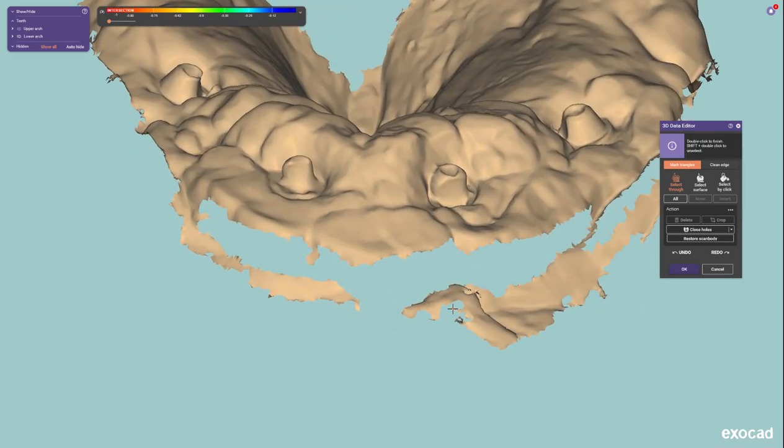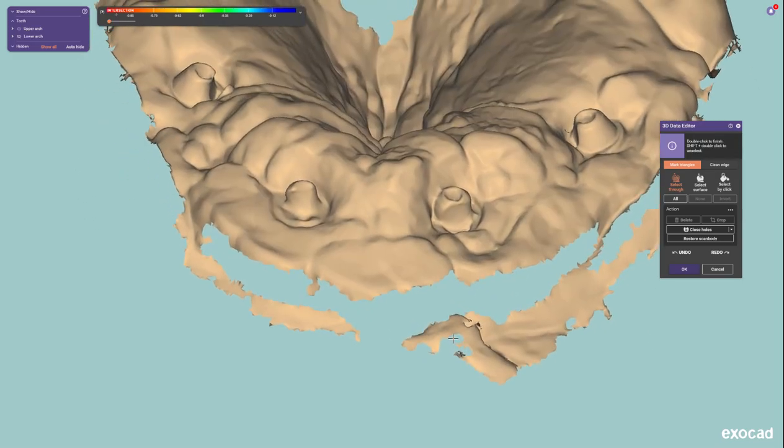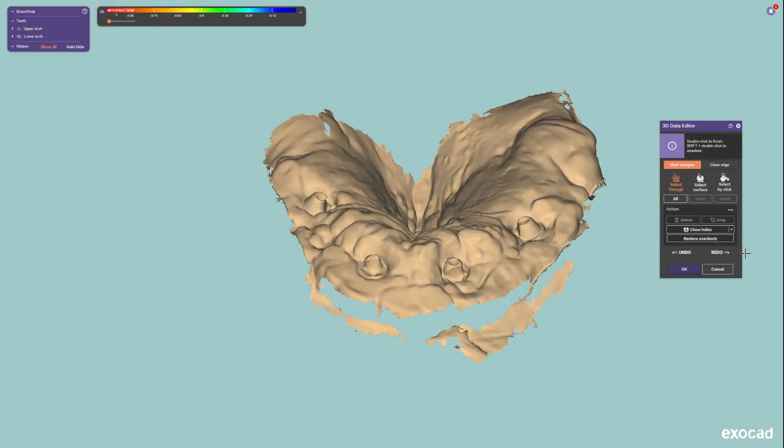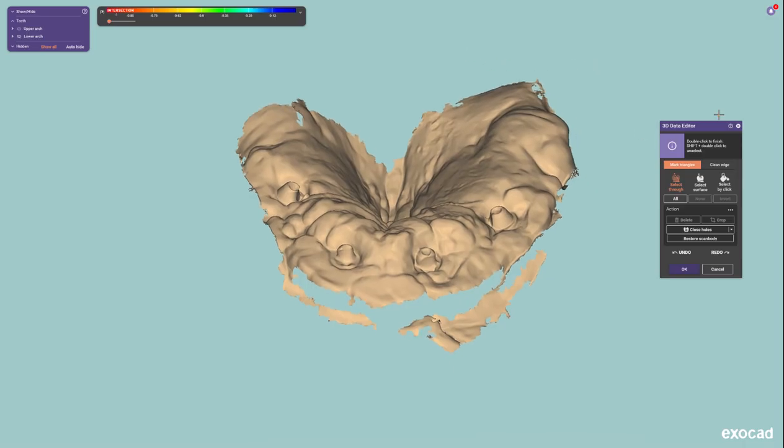Hello everyone, Joshua Jackson here with Evolve Dentistry. Today I'm going to be reviewing some new features inside of the 3D data editor tool inside of Exocad 3.3.